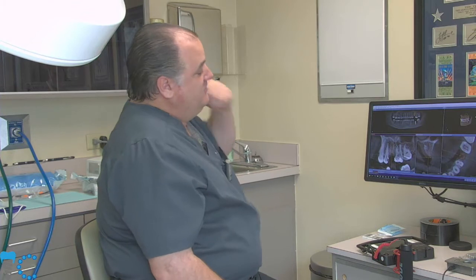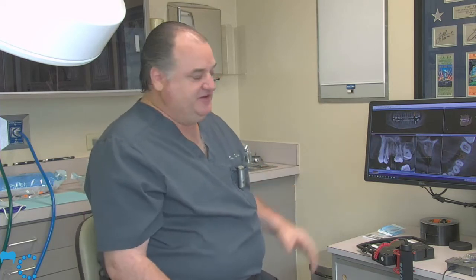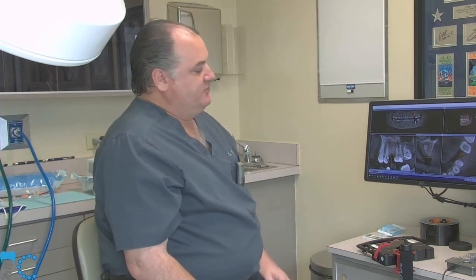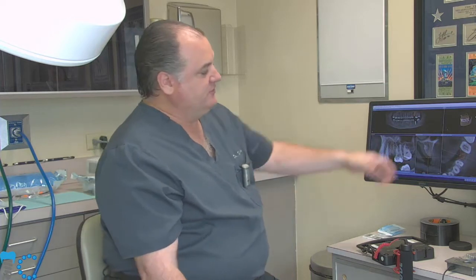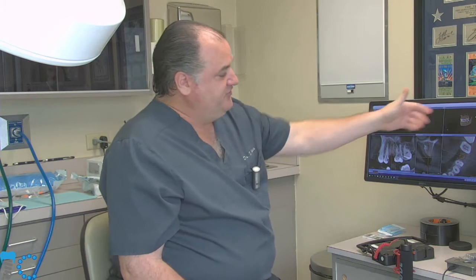In this case, we have adjacent teeth, which makes this pretty simple. All we have to do is establish a proper angulation and get our implant right smack in the center here, and this should be pretty straightforward. So for us, we don't use a surgical guide typically in this situation, but if we were placing consecutive implants, we would have some sort of a surgical guide. If we had an edentulous distal extension, no posterior molars, again, we would use a surgical guide to make sure we get our placement right.